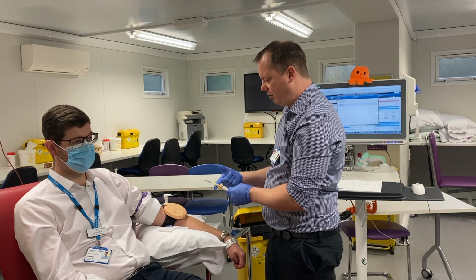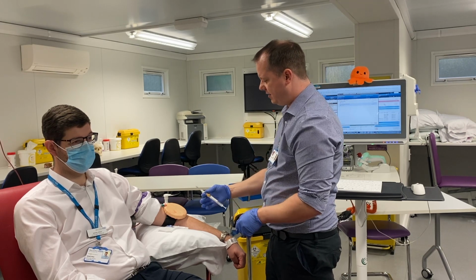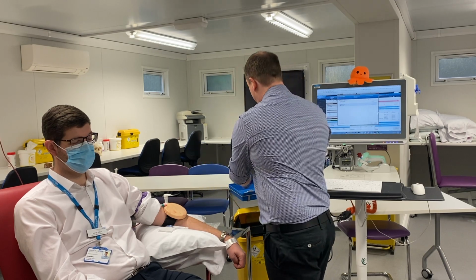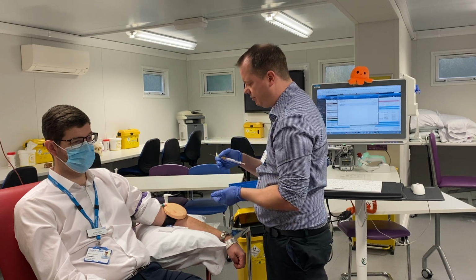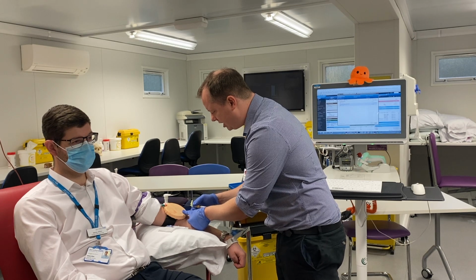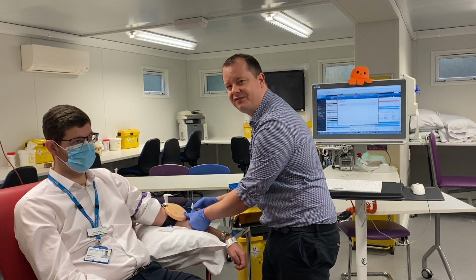I'm going to make sure I hold it correctly between my forefinger and my thumb. I can then use my other fingers to steady myself. I'm going to make sure the bevel is up, so the whole of the needle is up and the point is going to be pointing down. And I'm going to use my other hand, my non-dominant hand, to stretch the skin and pull the skin tight so that anchors the vein steady.